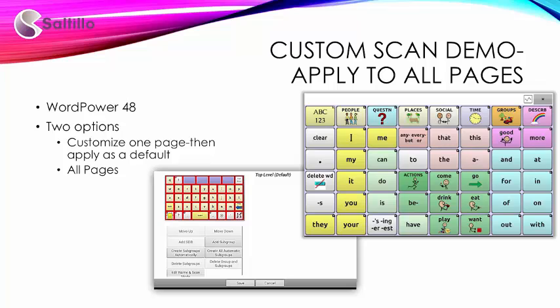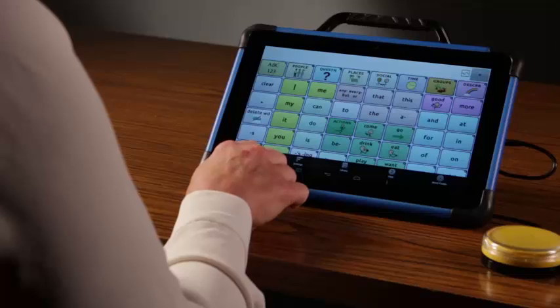If you were to create a new vocabulary or rearrange a current file that would lend itself to a custom scan pattern, you might decide to create a custom scan pattern and apply it to all pages. I will continue this demo using WordPower 48, one switch, leaving it on block pattern from last demo and turning off the auditory prompt. I have not made changes to this file nor am I making a recommendation to use this scanning pattern with this file. I am creating the scan pattern here for demonstration purposes so that you can see the capabilities with the scan editor.